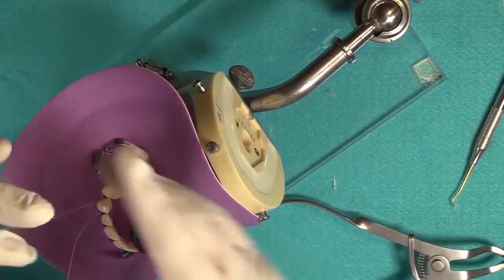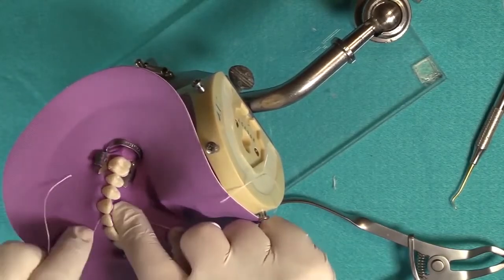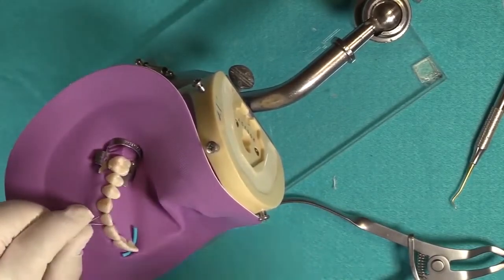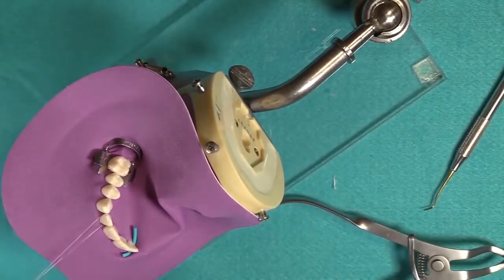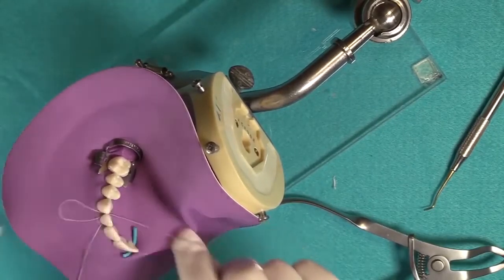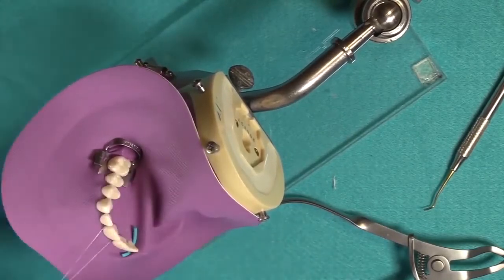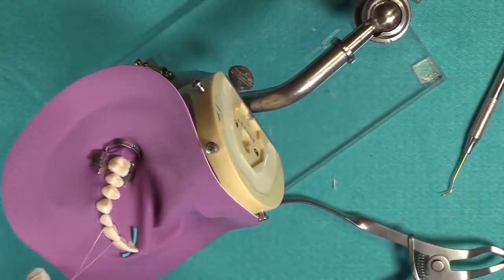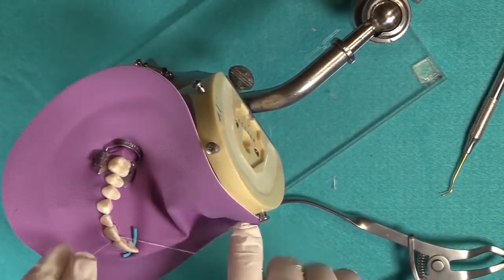Yes. Okay. Now, at this point, I could take the distal piece of floss and come out. Now, instead of coming out of the contact, I could continue on throughout the whole arch. So this is what I find that I do when I'm working by myself, because it's easier. Now, I'm going very slow to demonstrate this procedure, but I usually go much faster than this. But you see how you can move across the entire arch like this? Just simply, and see how nicely it inverts? It really does a nice job.